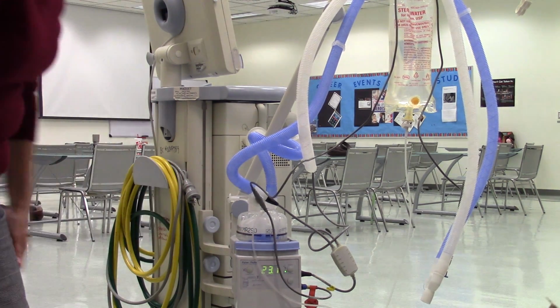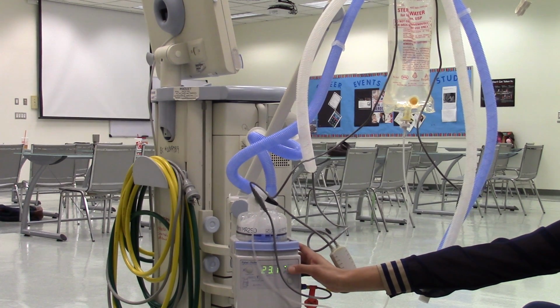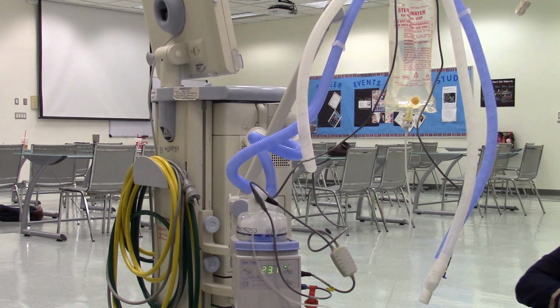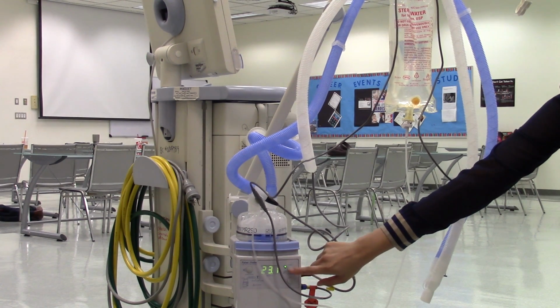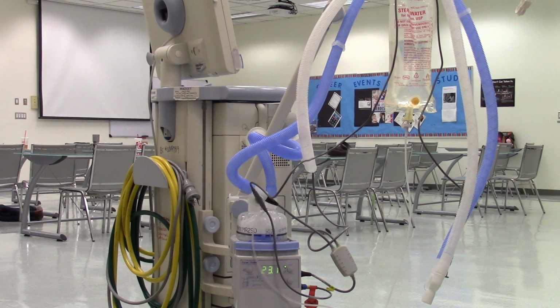Susie, do you want to try putting it back on invasive? There it goes. Only two modes? Yes. Invasive and non-invasive? Yes. Gotcha. It has a little face, and like two little faces. So you hold it, put it on one, and then the other one.